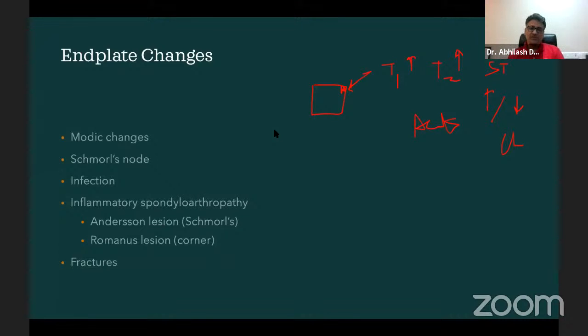What happens to Modic changes post-contrast? They can vary. They can enhance, they can not enhance. So the sclerotic ones won't enhance. The edematous changes may enhance. So enhancement is not something that has been particularly helpful in differentiating Modic changes from anything else.